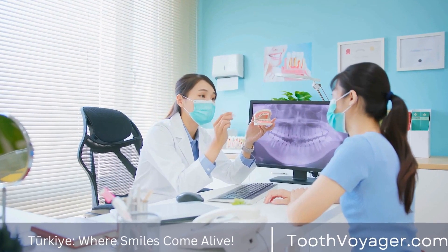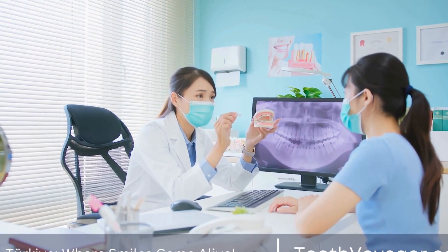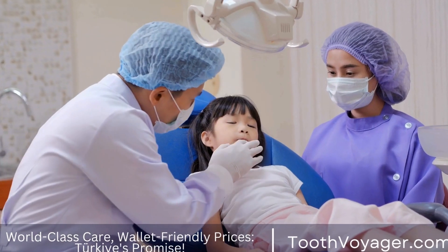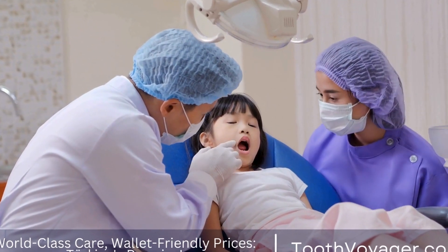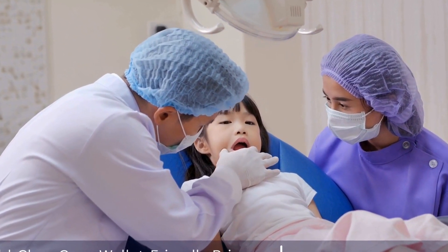Fabrication: Once the impressions are taken, the dental laboratory will fabricate the crown using the chosen material. This may involve techniques such as CAD-CAM technology, where a computer is used to design and mill the crown to precise specifications.